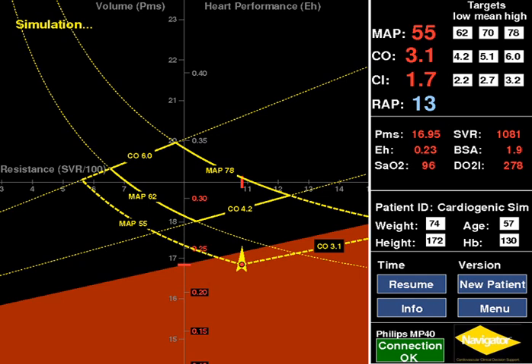There are three main features. Firstly, you can see grey-coloured X and Y axes. The Y axis has two scales. The left scale is the volume PMS scale and measures the patient's volume state. It moves vertically in response to changes in the patient's circulating volume state.